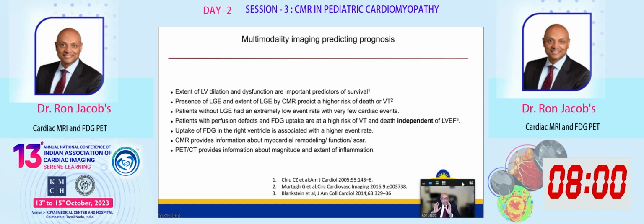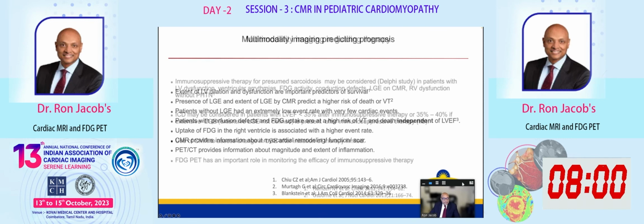And remember that one point: independent of EF, the LGE will predict adverse events. Right ventricular involvement is another sign, another index that will increase your chance of having adverse events. So a couple of points.